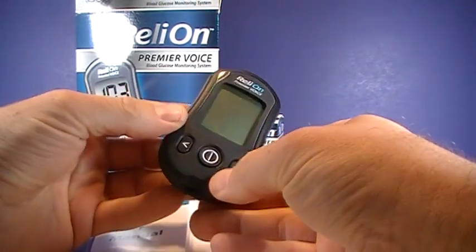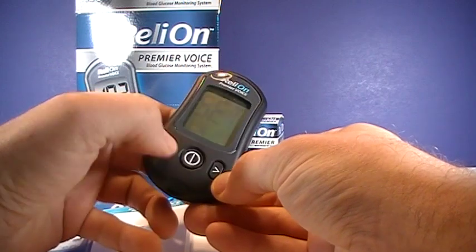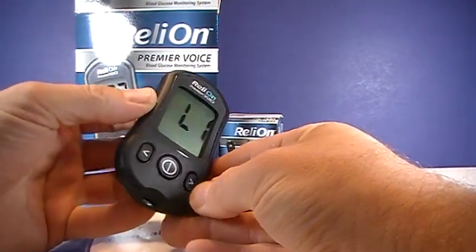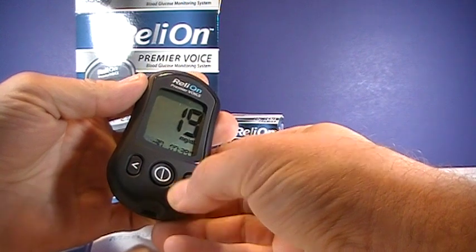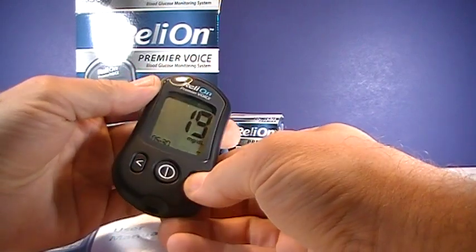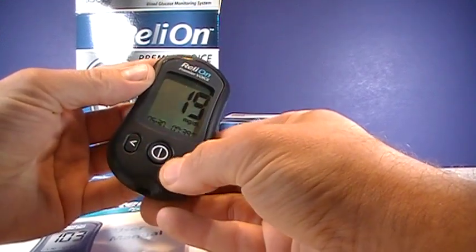To set the time and date, just hold the center button for about three seconds. It'll say 'Set meter.' You push it again — language selection: English or Spanish. Then set year, set month, and set date, using the arrows to adjust. Then set time — 12-hour or 24-hour, your preference — and set the hour and minute using the arrows.